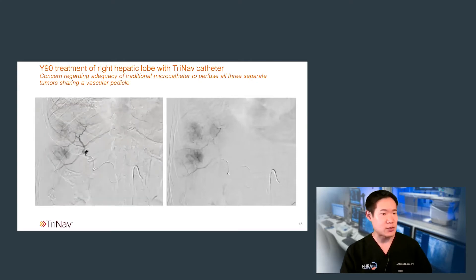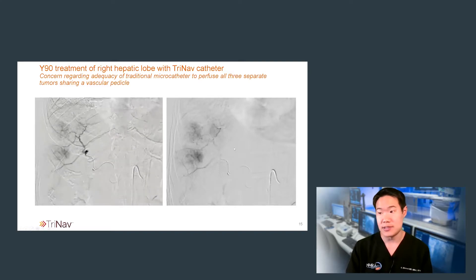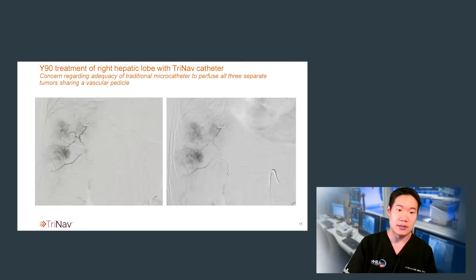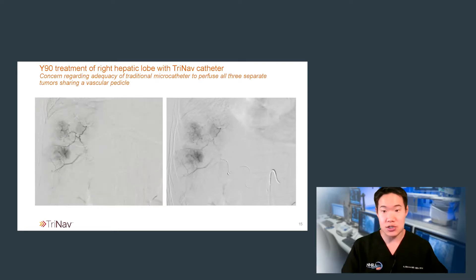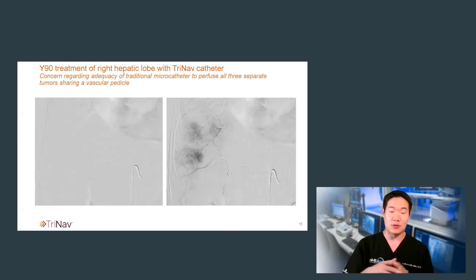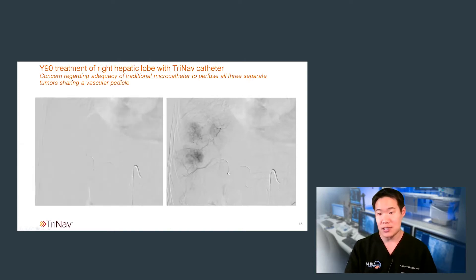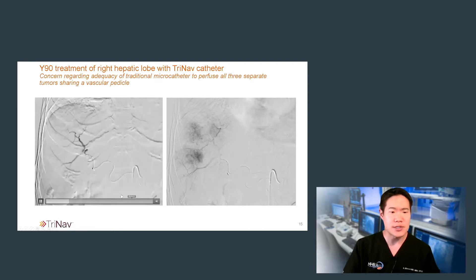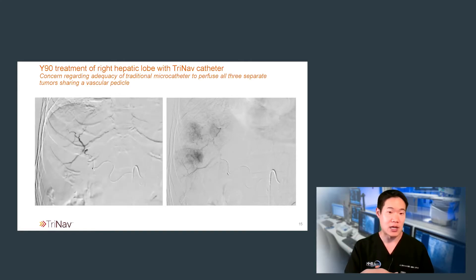So now we move on to the treatment. I started off by treating his right hepatic lobe disease. You will recognize the TriNav catheter with its proximal and distal markers on this angiogram — the catheter is in a pretty similar position to that seen on the mapping angiogram. With the catheter in place, even a gentle injection creates a very intense contrast blush within tumor, so I was pretty comfortable about getting preferential flow towards the tumor. I noticed decreased perfusion to the normal hepatic parenchyma, as there is decreased contrast load within the inferior-going branches. This angiogram is really a testament to TriNav's ability to influence the hemodynamics of the liver angiosome.